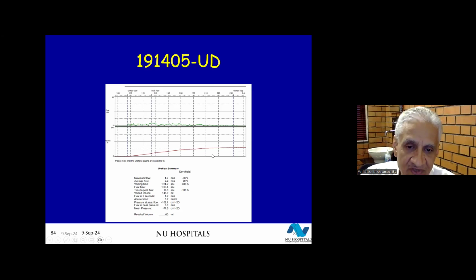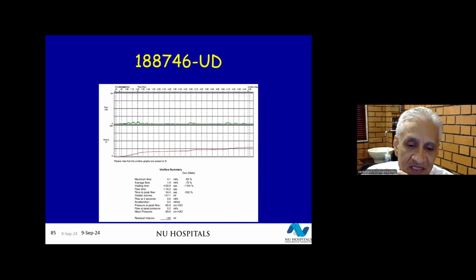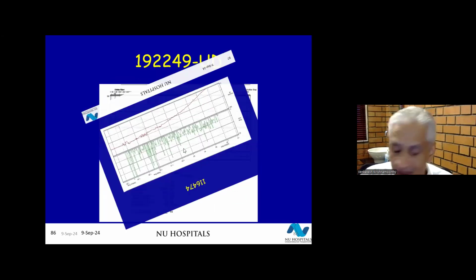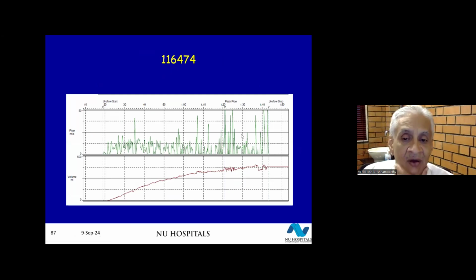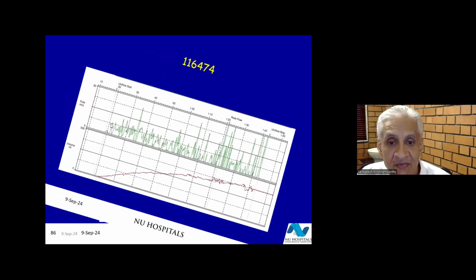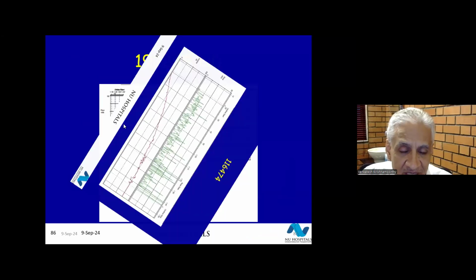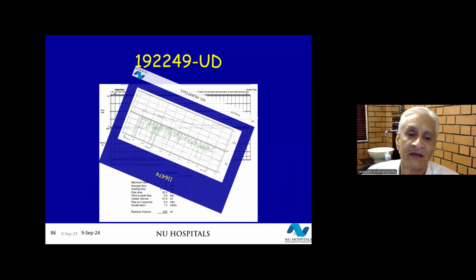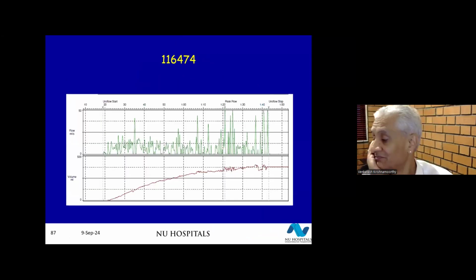I'm talking of, these are all proven by urodynamic study. And you will see that this is the kind of flow that you will have. Probably these are the extreme. These are the extreme, but remember, the ultimate result of this, as I told you, can be because of the bladder, can be because of an obstruction, mechanical or dysfunctional obstruction. Okay, who wants to? Priya, do you want to give an opinion on this graph?